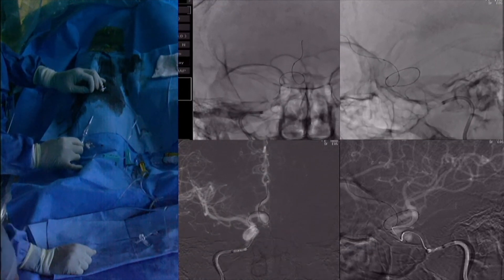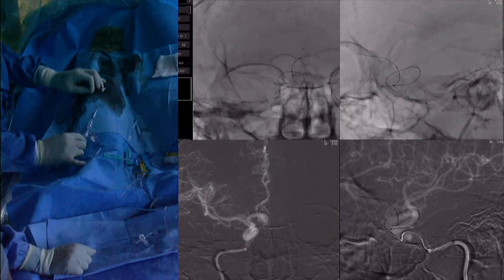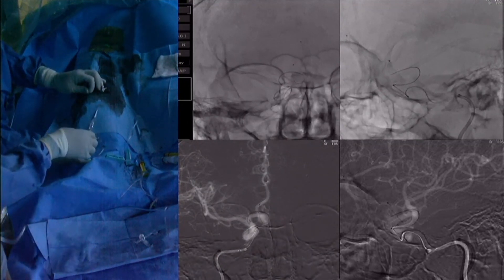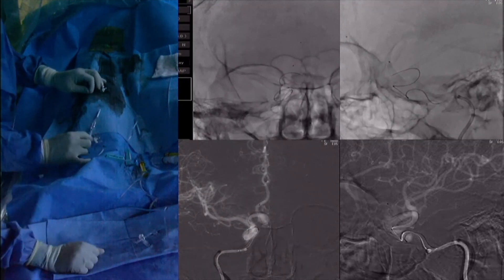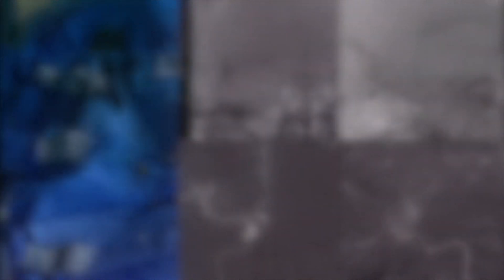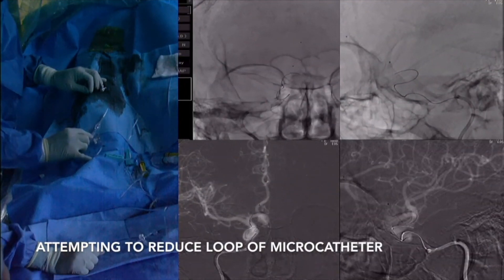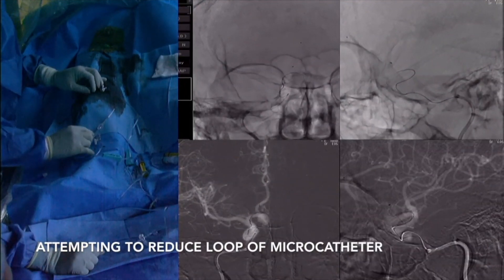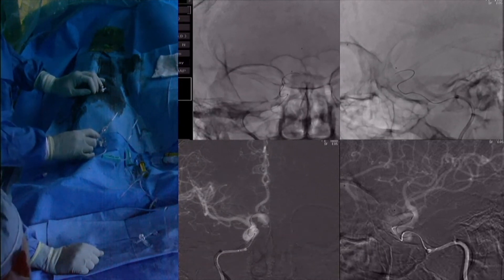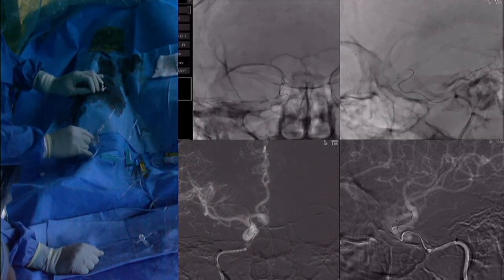Once the wire was around the aneurysm and placed in the distal A2 segment of the anterior cerebral artery, we then navigated the microcatheter around the aneurysm over the wire into the distal segment of the A2. We attempted to reduce the loop of the microcatheter in the aneurysm by slowly pulling back on the catheter. However, this resulted in the entire catheter migrating proximally without reduction of the loop, as shown here.